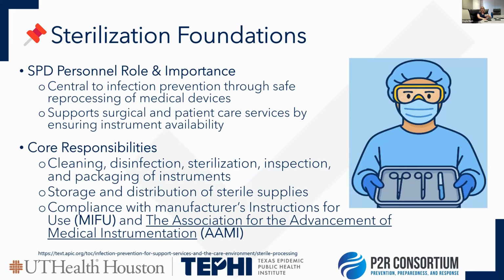So sterilization occurs in the sterile processing department, or SPD, and the role of these individuals is crucial to make sure that we are sterilizing our sterile surgical instruments and storing them appropriately to ensure patient safety, to help reduce surgical site infections and reduce harm events to patients due to lack of sterilizing equipment correctly. Their core responsibilities are cleaning, disinfection, sterilization, inspection, and packaging of these instruments. They will also store them and distribute them in sterile processing.